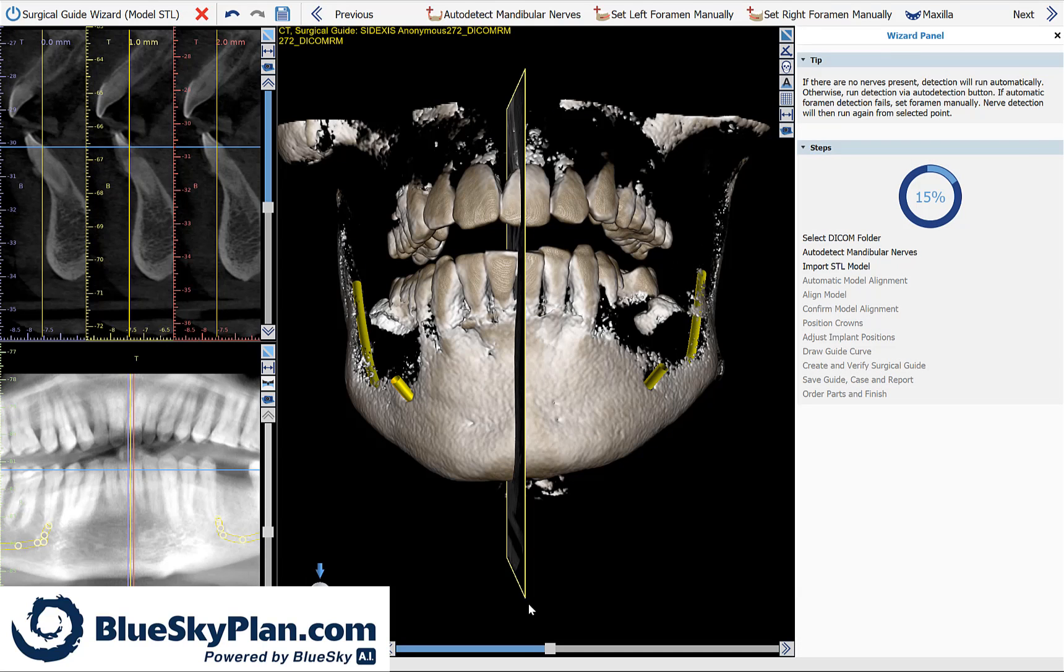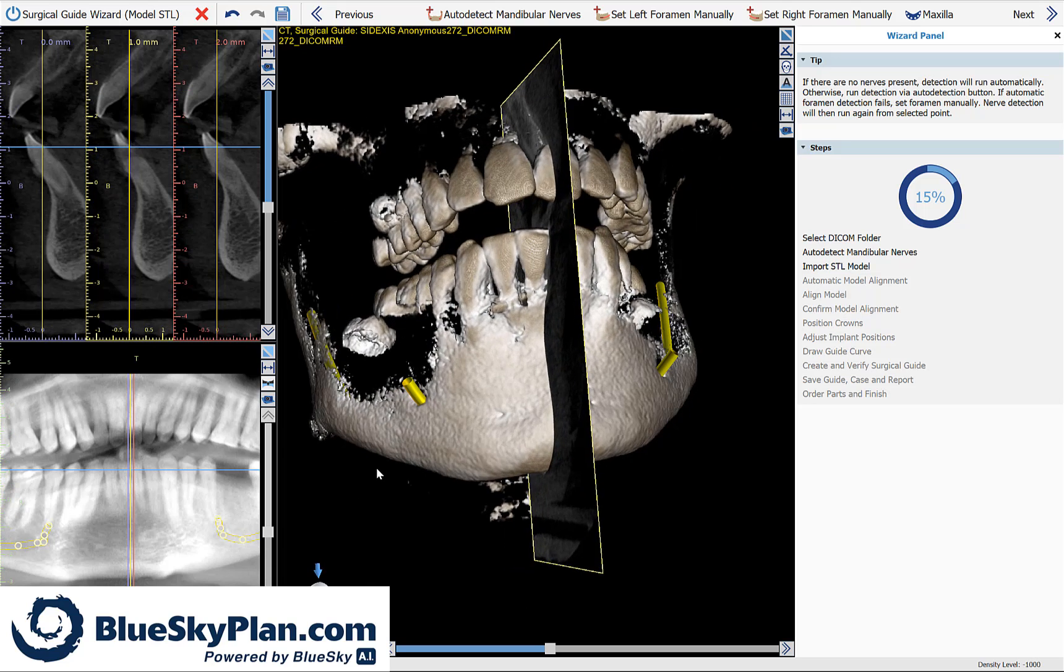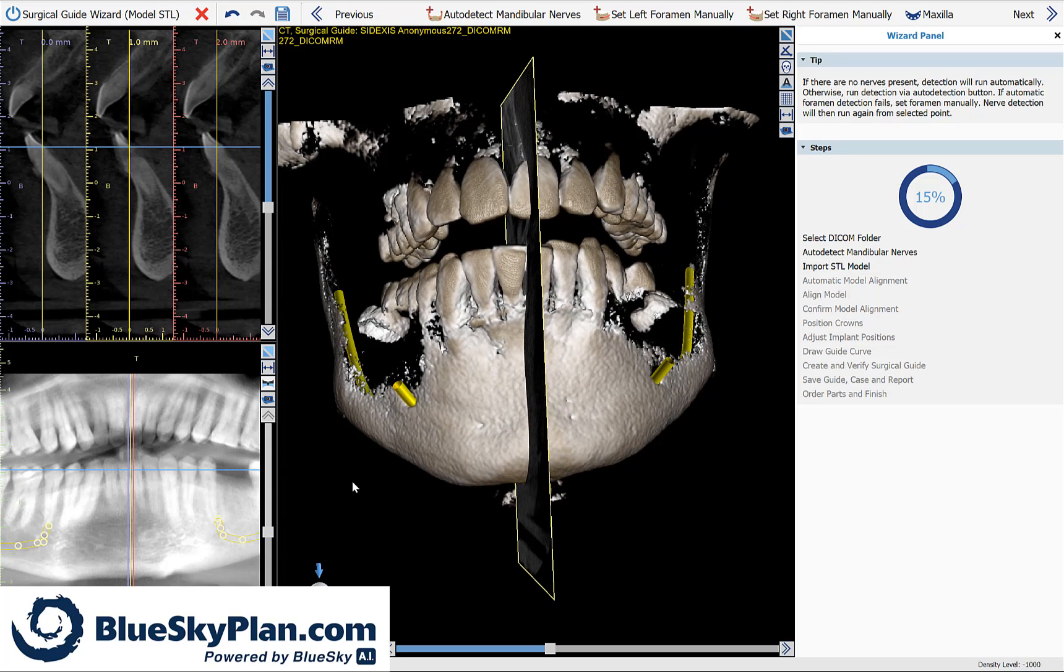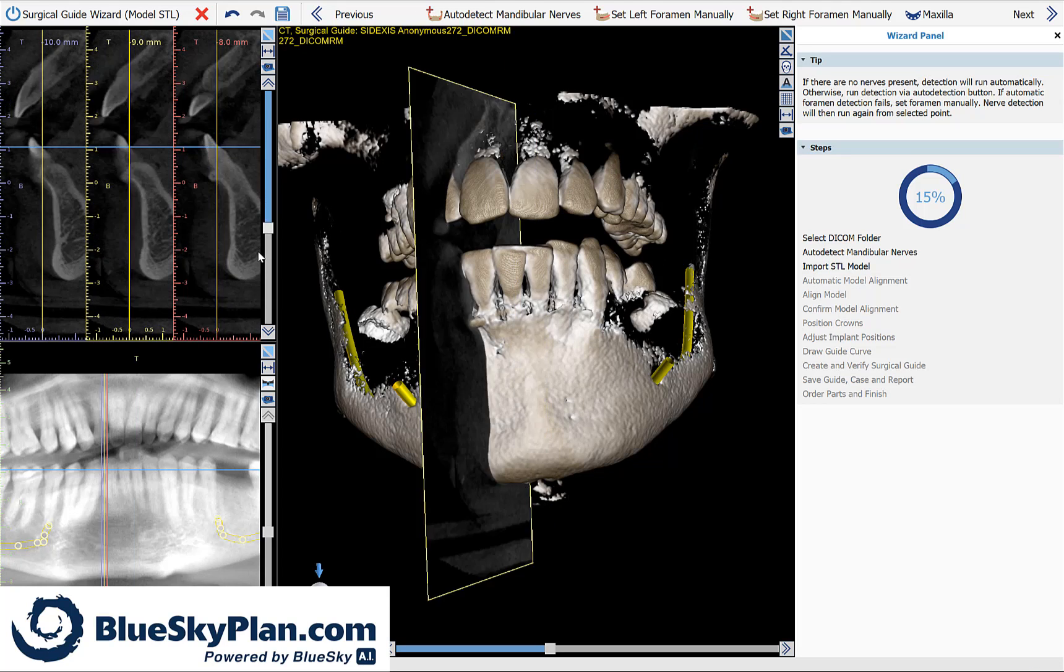The software is now automatically detecting the nerves and you can see the detected nerves in all the views on your screen, 2D and 3D views.